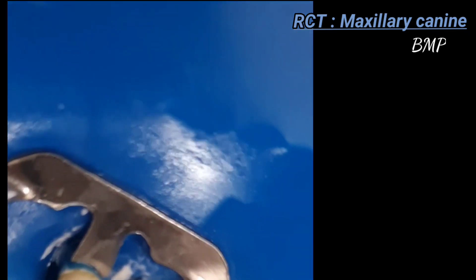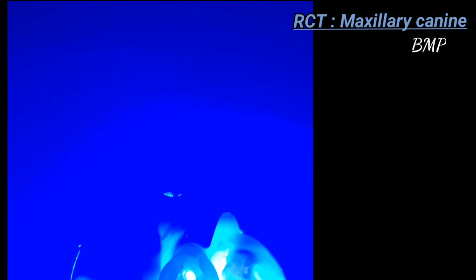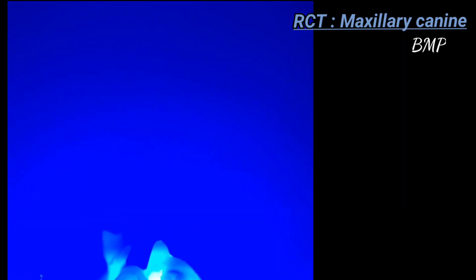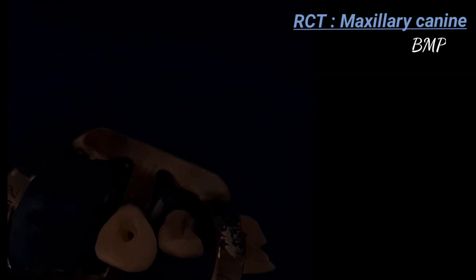You can also identify the root canal in a dark room. Once you create a dark space and use an LED light at the CEJ, you can nicely appreciate the canal. The canal appears oval to circular in shape. If there is any calcification, the light will not pass through. You can see there is no blockage — the canal is nicely visible using this dark room technique.